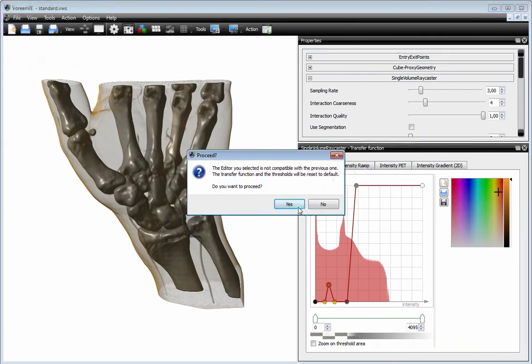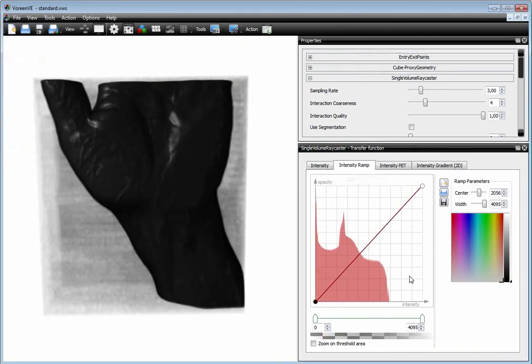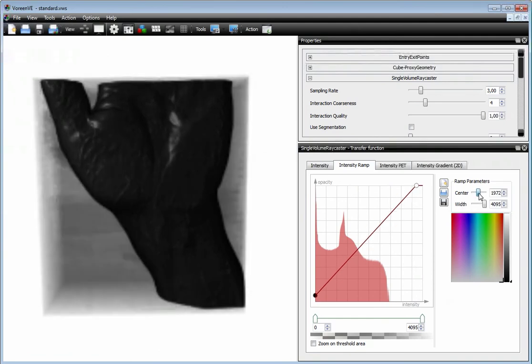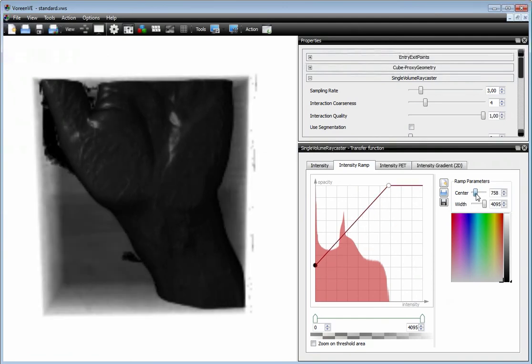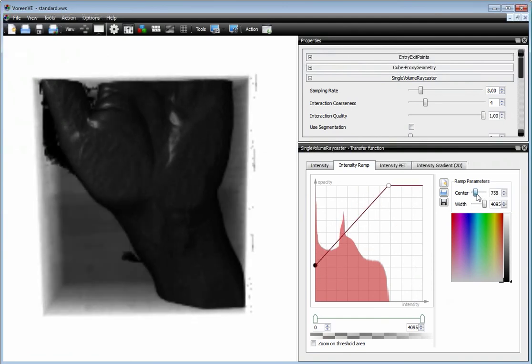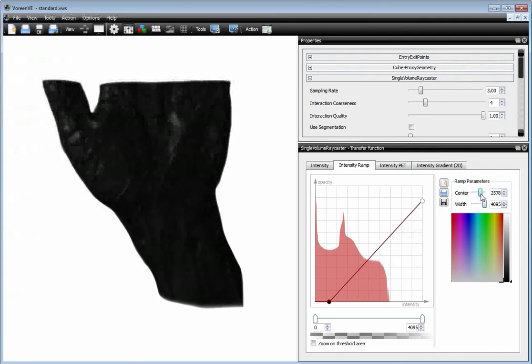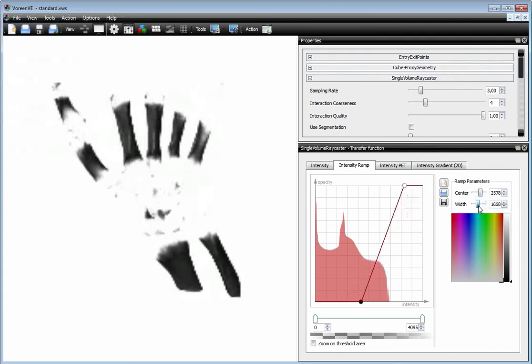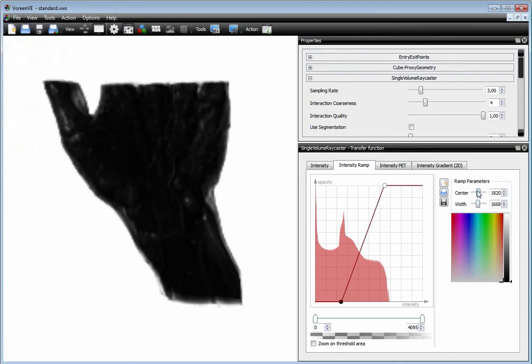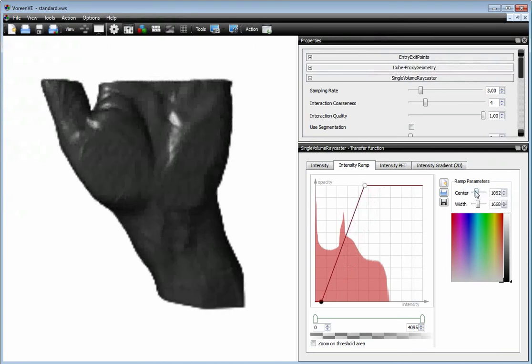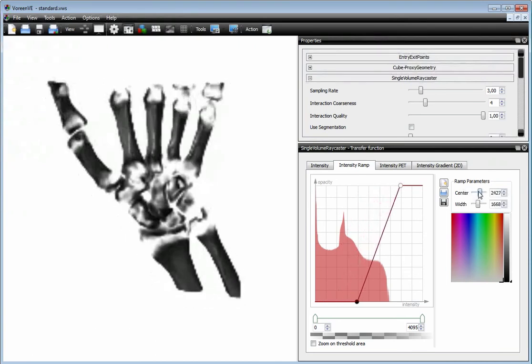The intensity ramp is basically a transfer function which is similar to the windowing approach. So you set the center of the ramp, and then you set your window width, and so you can explore the dataset based on this.